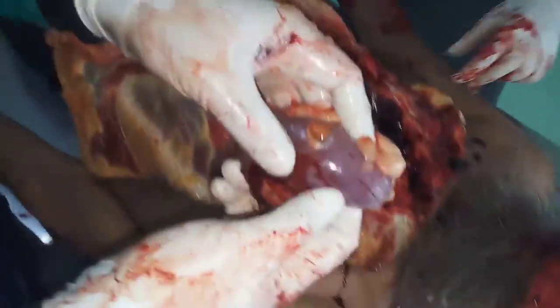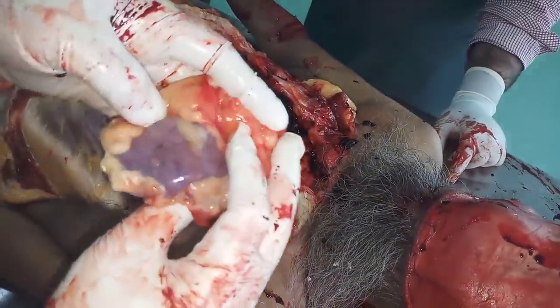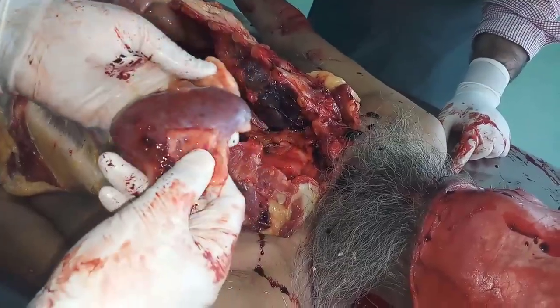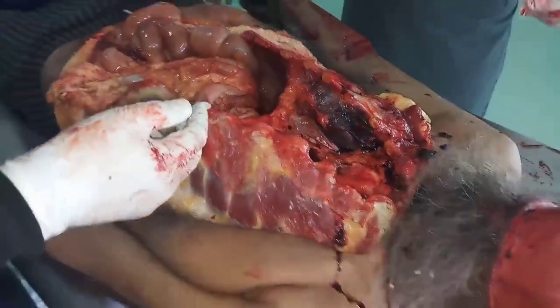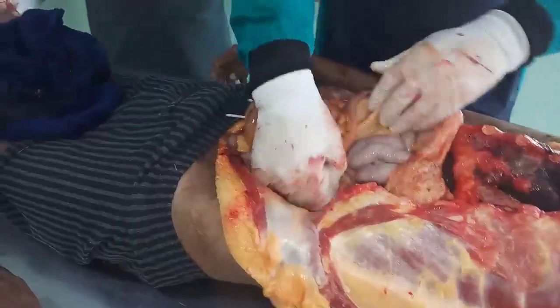So kidneys, you can see the cysts, even multiple small cysts are also there on the surface. Okay. I will go for the kidney of the other side.